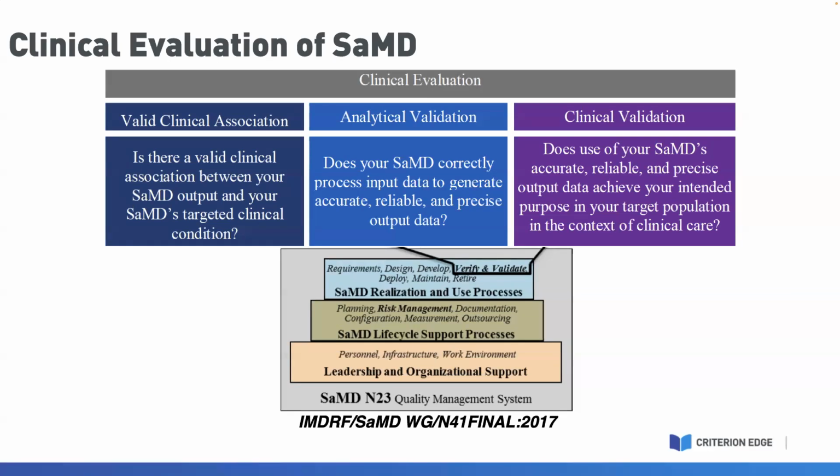So the processing of that input data and the generation of the output data provide an appropriate level of accuracy and reproducibility, all of the same types of factors that we take into account when we evaluate an IVD, things like precision. So all of those types of performance measures are still appropriate, whether you're talking about the IVD or the software.